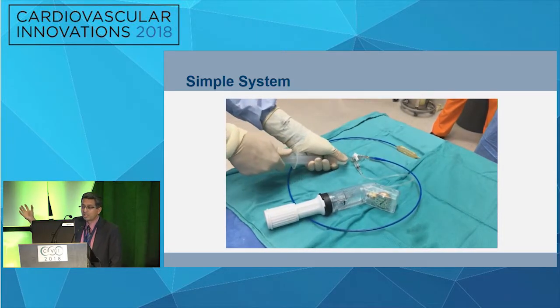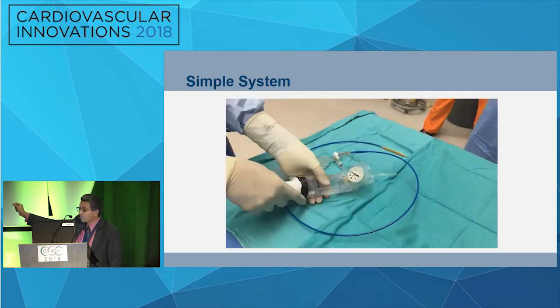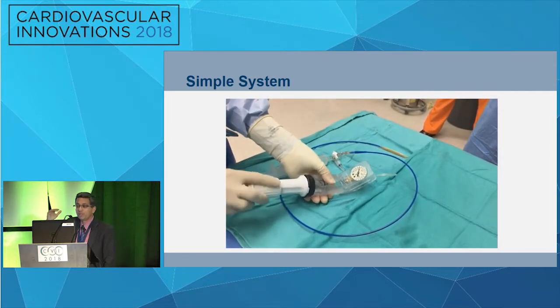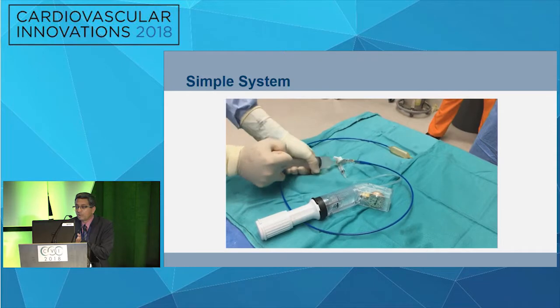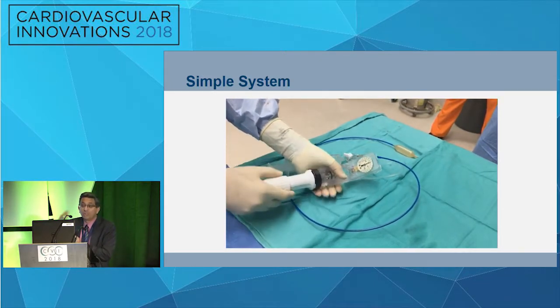We published it in CCI, so this video is there. But the idea is that the stopcock is closed, you inflate the indeflator, keep the indeflator at high pressure. So when you're inflating the balloon with the big syringe, and if you flip, you already have 6 or 8 or 10 pressure inside, you can go to 18. Otherwise, if you try to turn it, it will take forever.